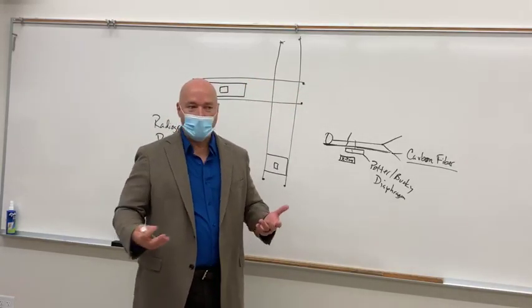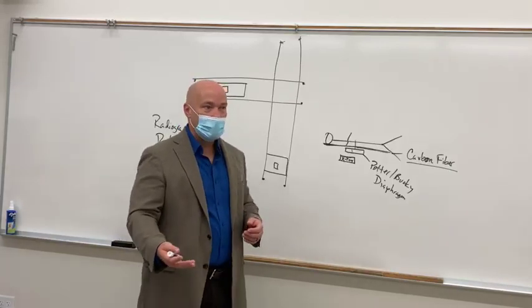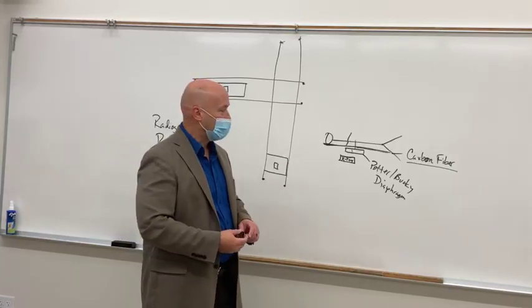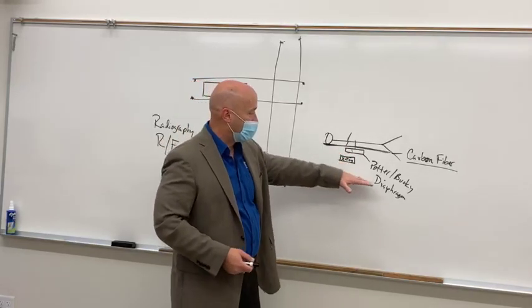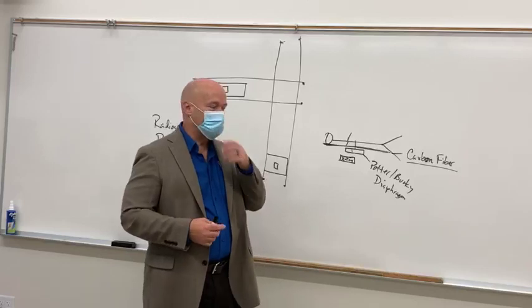So the patient had open heart surgery. Those wires are made out of metal. So since they're metal, they show up really well on x-rays. So we got this big hunk of metal holding our image receptor. We don't want to x-ray through that.